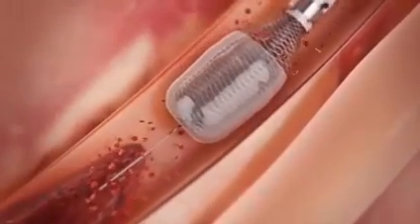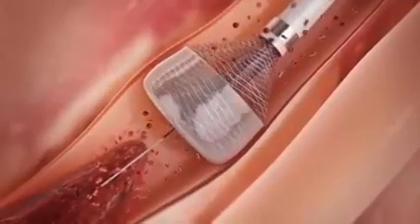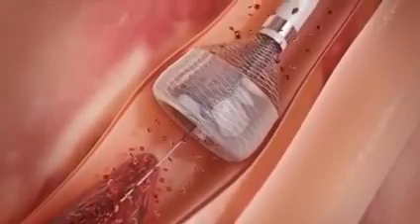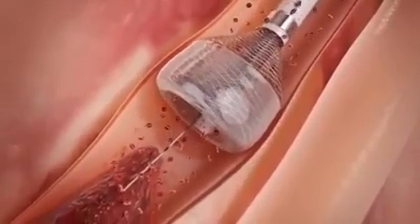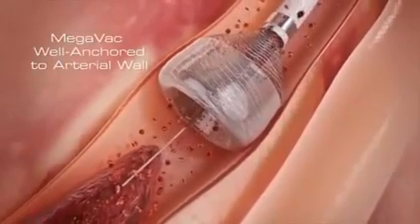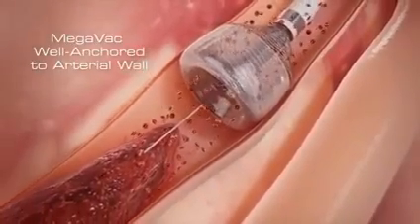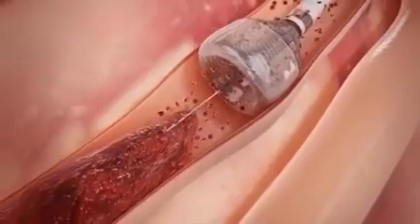The patient's blood pressure, along with the radial force of the funnel tip, combine to press the device against the arterial wall, anchoring the catheter firmly and safely. The outward expansion of the MEGAVAC anchors and centers the device, and can be used as an anchor for other devices in crossing tight lesions or tortuous vessels.